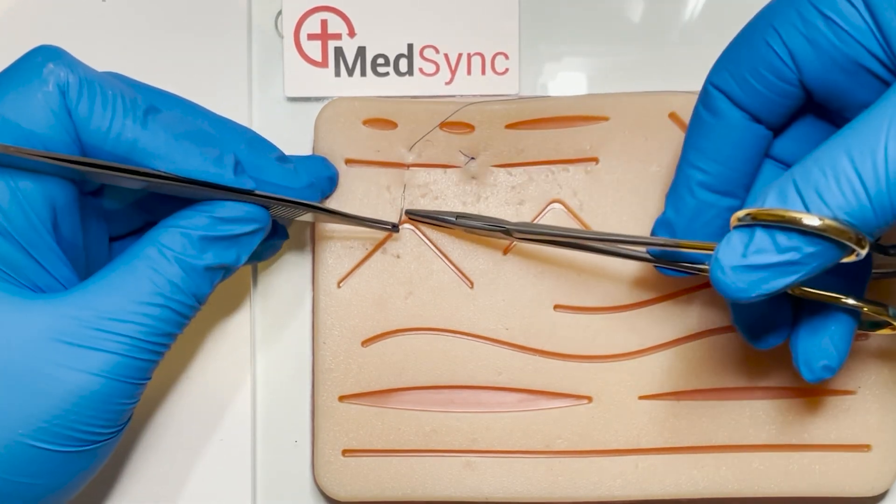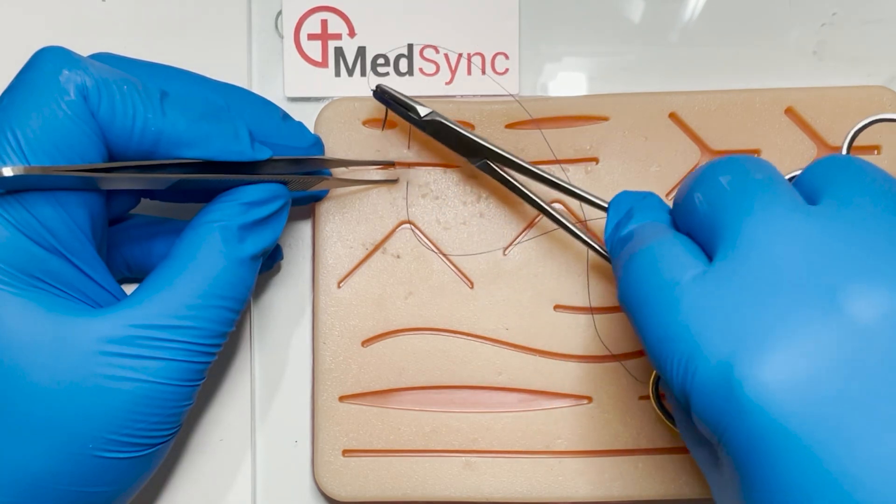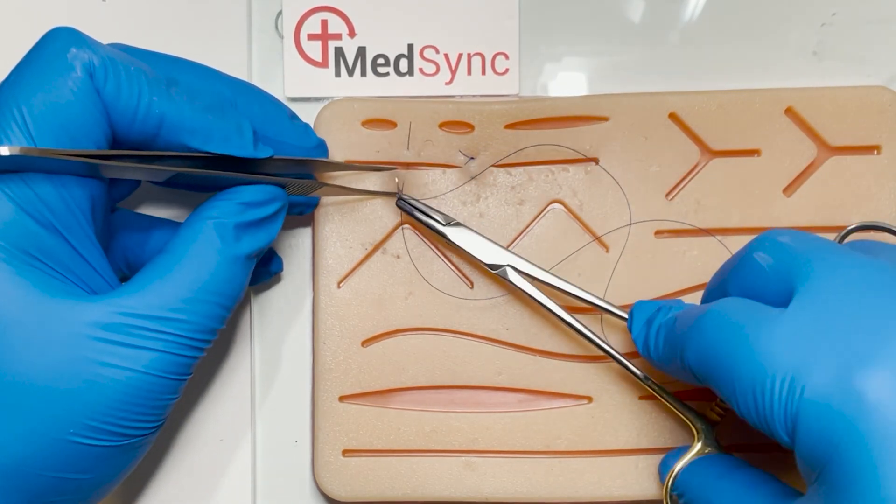The second is a single-instrument, single maneuver, using the skin of the patient within the operative field as demonstrated.